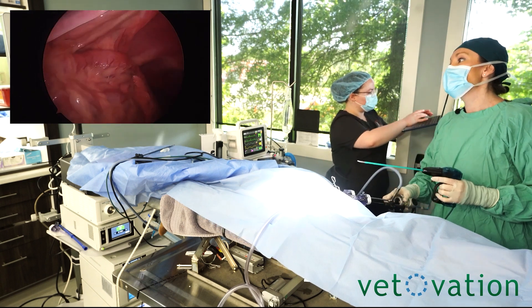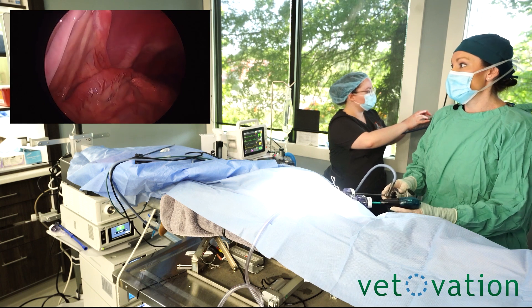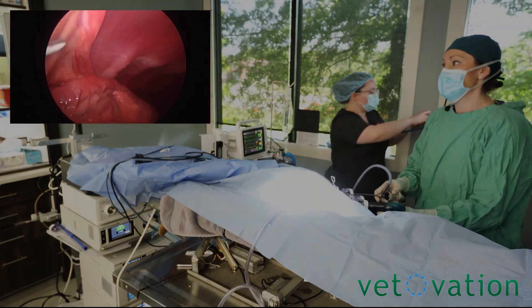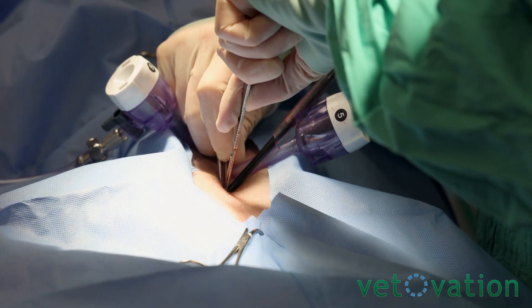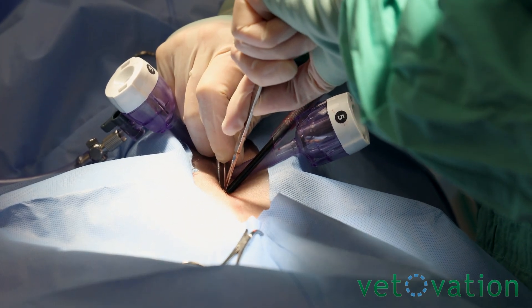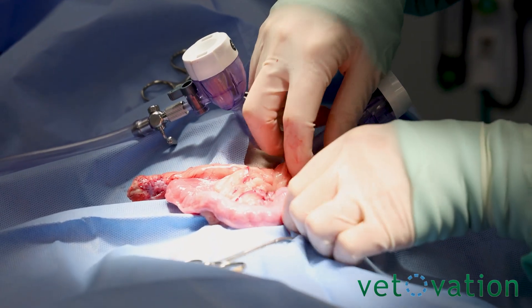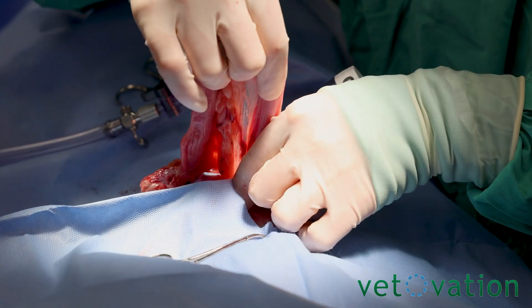When you're first learning there's a learning curve, but most of my doctors are comfortable within their fourth or fifth procedure. You have to be ambidextrous. So what I'm going to do now is focus on the uterus and ligating off the uterus.